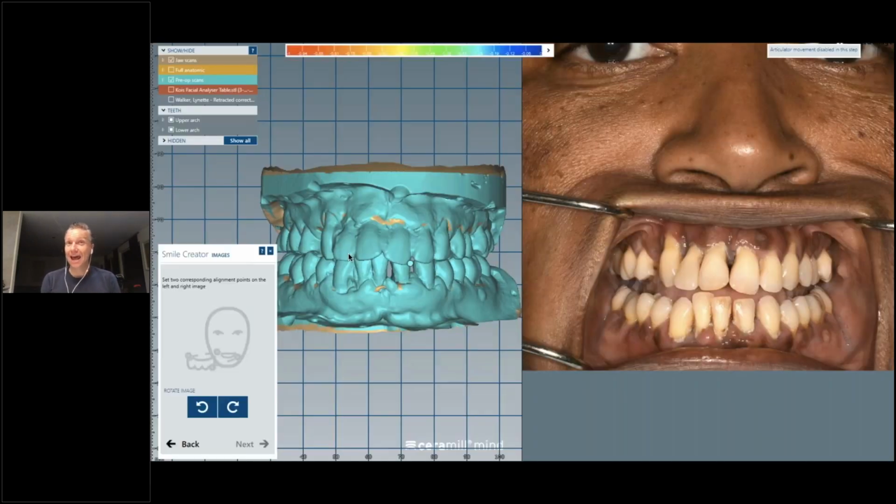So this patient, you can most likely tell, is not happy. For her, the only treatment option from her dentist's perspective was extracting everything and doing a hybrid upper and lower, basically all-on-4, in this case all-on-6s on the maxilla and mandible. To start the treatment, here too we want to plan a guided surgery. With the surgical guides, we do immediate loading on the day of surgery, and then the final. I will show you the treatment from start to finish.